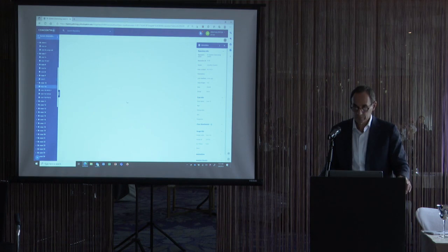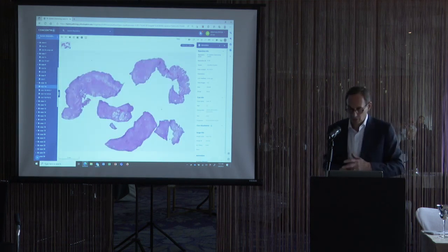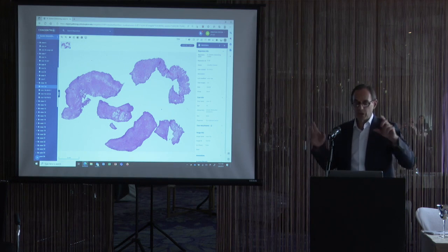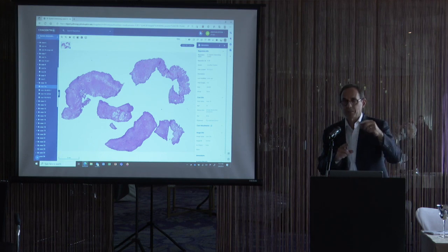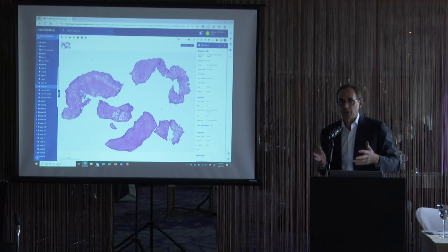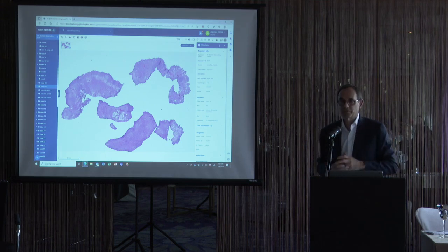Would schwannoma come in the differential in this case? Yeah, schwannoma would be something potential. The biggest difference is that every schwannoma I've seen on a prostate needle biopsy has been extraprostatic. I don't think I've ever seen a schwannoma in the prostate. You can still see it on a needle biopsy because sometimes the needle goes through a nodule that on rectal exam was thought to be in the prostate but is actually a schwannoma outside the prostate. So it definitely is something you sometimes have to think about with a cellular spindle lesion if you didn't see those thick-walled vessels.